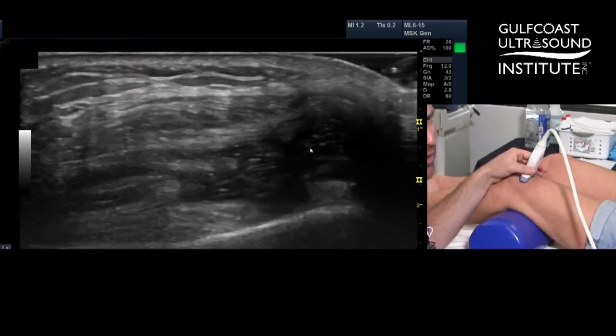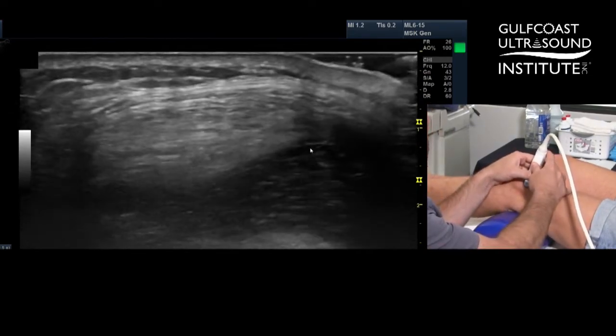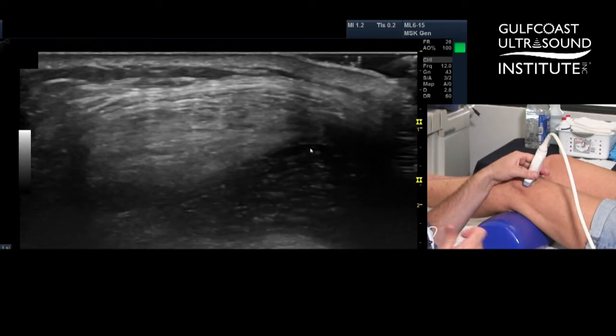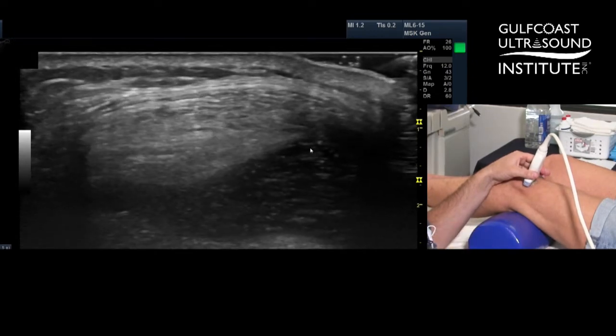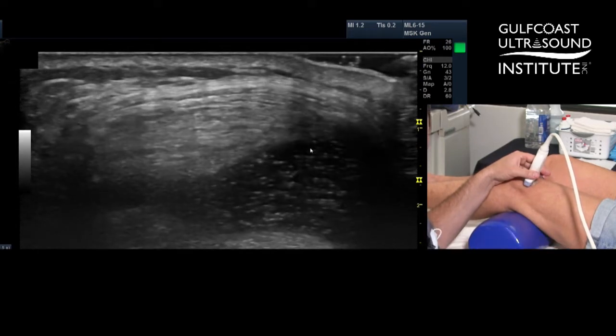Can you straighten your knee gently for us? So this is a little trick you can use: once we get this all drained, I'll have her flex the quad. It'll bring everything else from the lateral and medial gutter up into the suprapatellar pouch, and then we'll get more of it out.